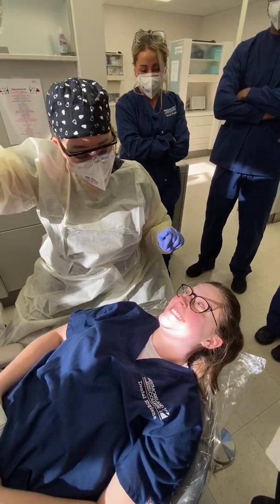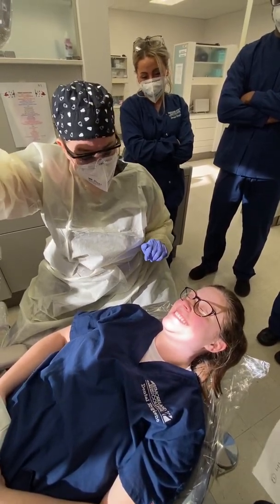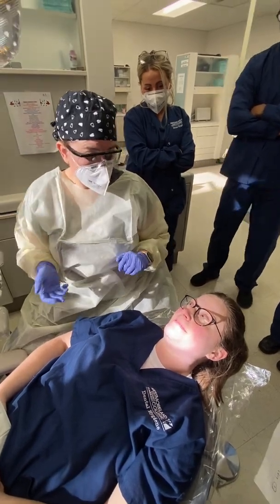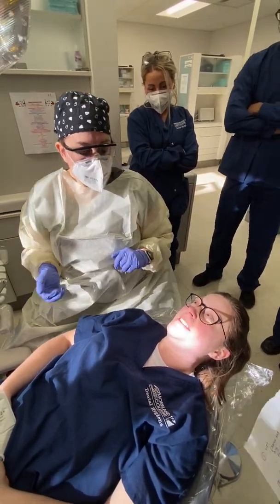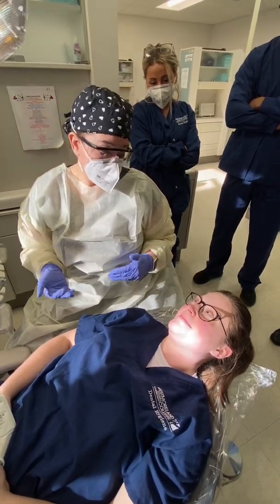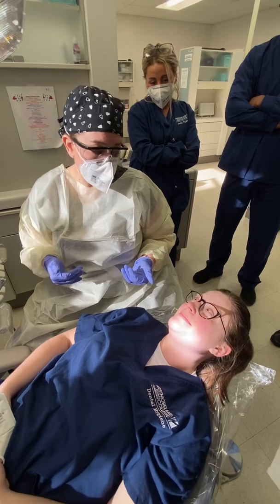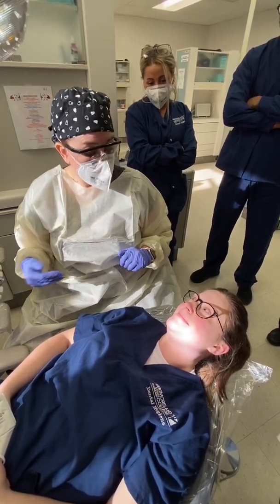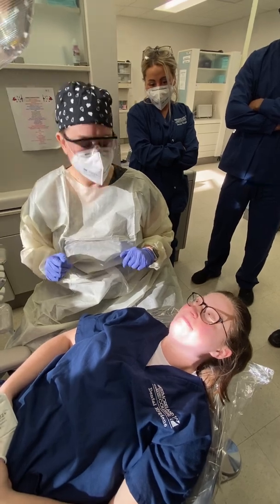So today we're going to be performing an intraoral exam on Miss Katie. Miss Katie, if anything feels uncomfortable to you during the procedure, please let me know. But this is just to get a baseline for what's normal for you. And we're going to be looking at your tissues such as your lips, your hard palate, your soft palate, your tongue. So we will go step by step and we'll document any findings.